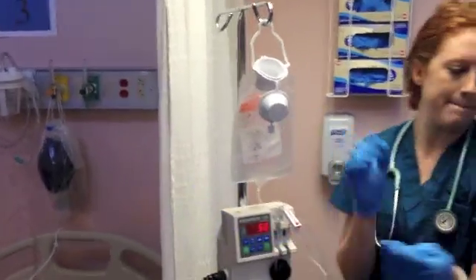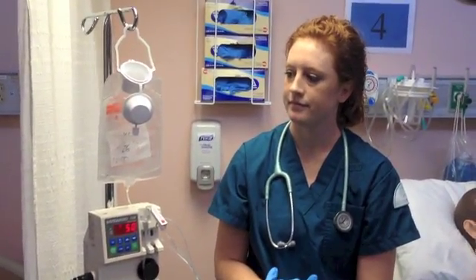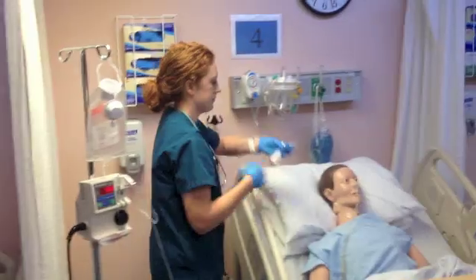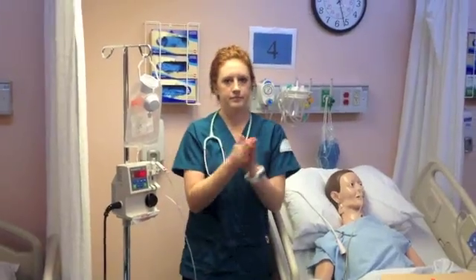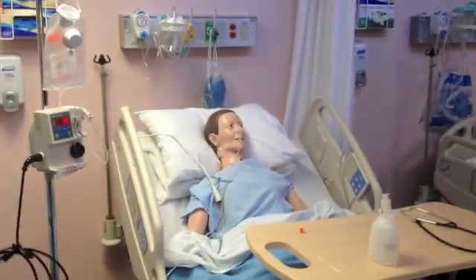Now this bag can stay up for 24 to 48 hours since it is a closed system. If it were an open system, it would have to be changed every 24 hours. Kelly is ready to leave our patient in a safe and comfortable position. Give the patient that call light. Remove her gloves and perform hand hygiene. Great job. And our last step is to document our procedure.